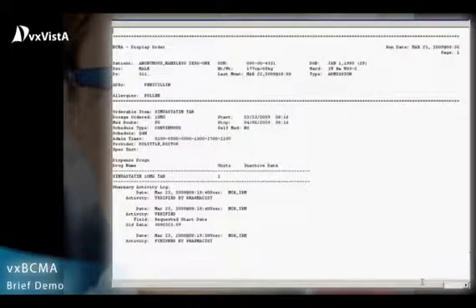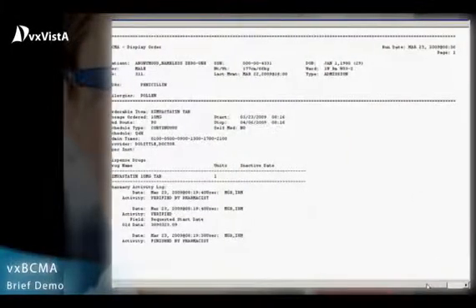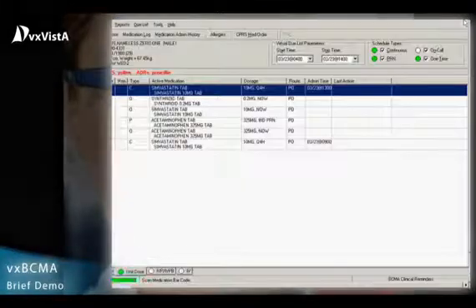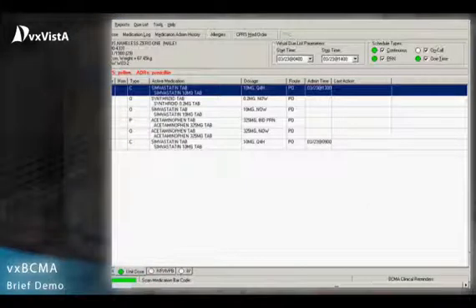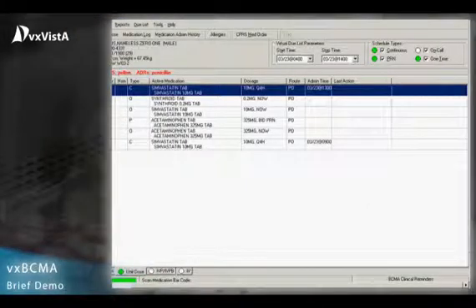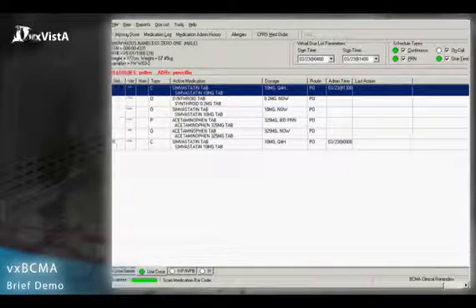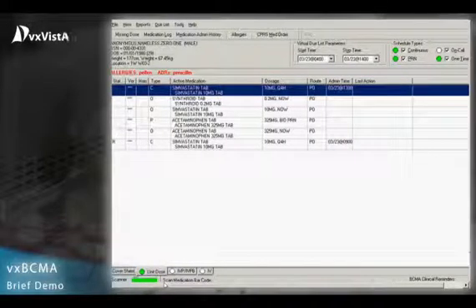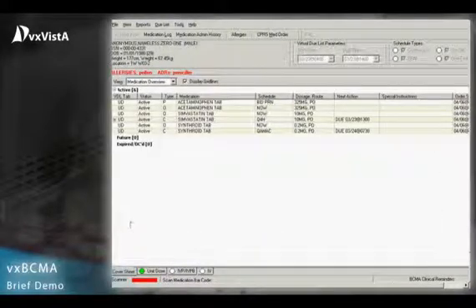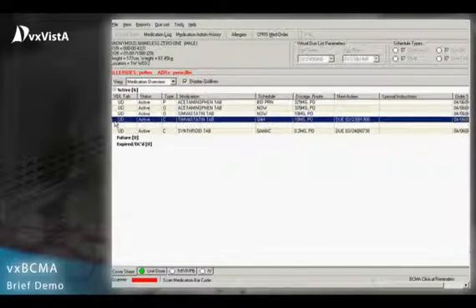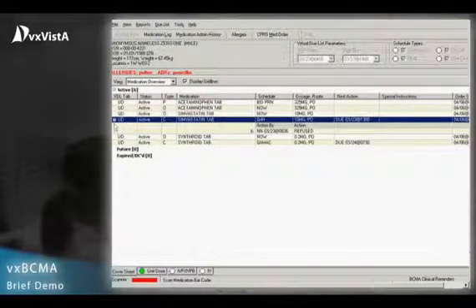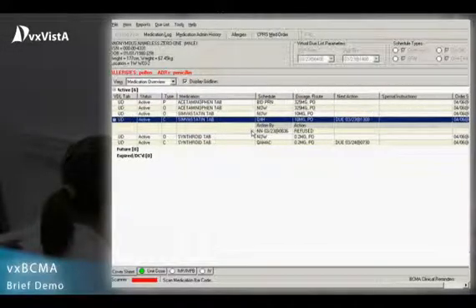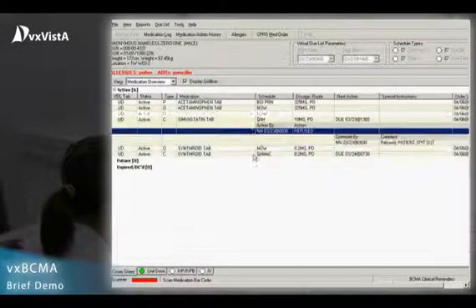Reports can be run for the Medication Administration Record, or MAR, for each patient. A separate tool for pharmacists allows parameters to be set for local control over settings such as the time variance allowed for early or late doses to be given.